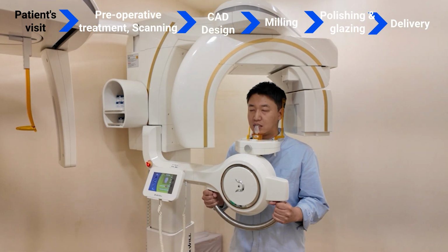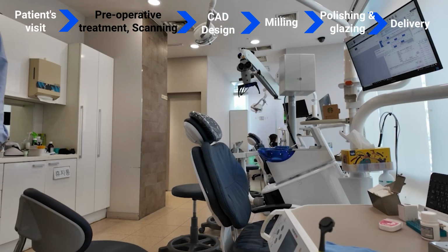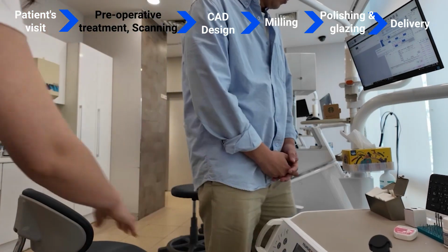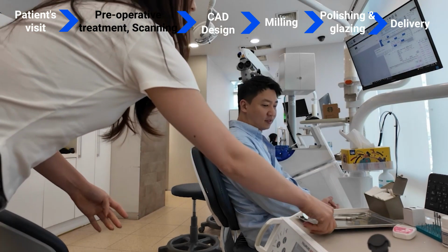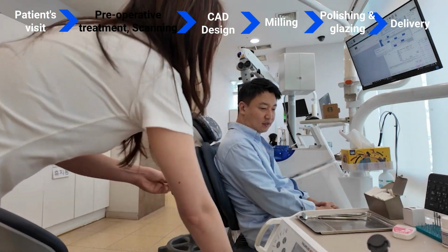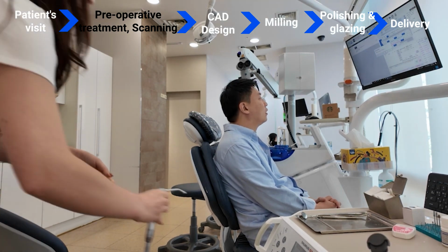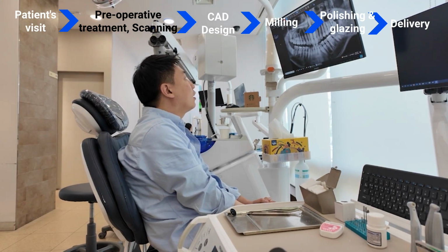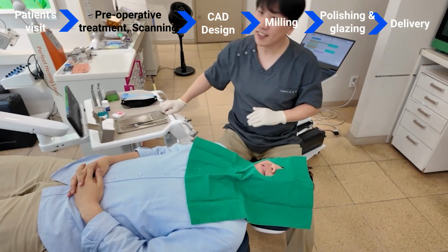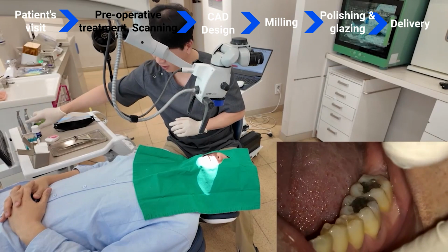First up, our patient undergoes a panoramic X-ray. This helps us get a clear view of the mouth and pinpoint exactly where the treatment is needed. Today, we're focusing on replacing an old amalgam filling at tooth number 36 with a ceramic inlay.